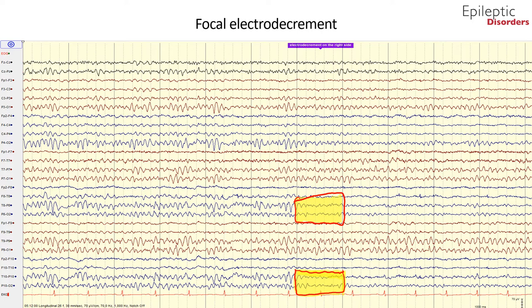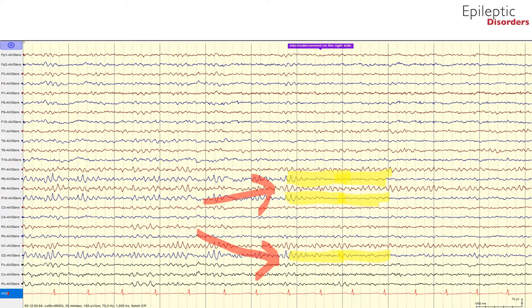The activity on the left side continues to be unchanged. In the average montage, in the 7th second of the page, there is sudden suppression of background activity in P8 and P10 and an attenuation in O2, highlighted in yellow, while left-side background activity continues unchanged. Focal electrodecrement is a common and important early ictal EEG finding which is often missed by young learners.